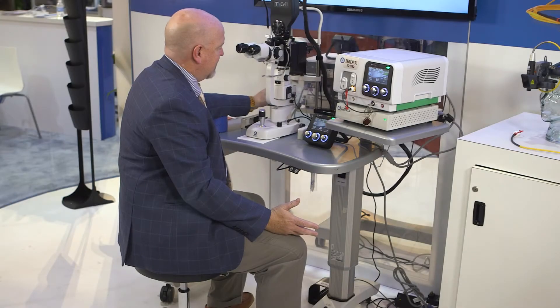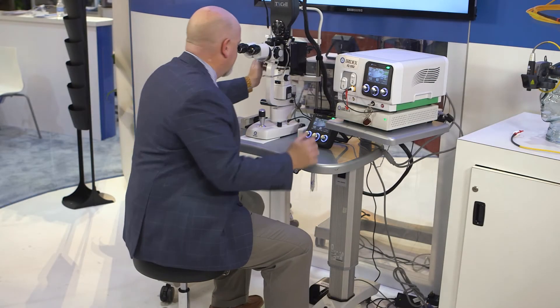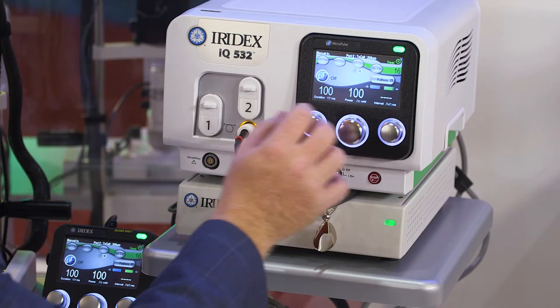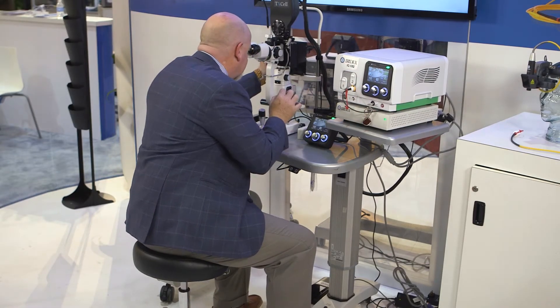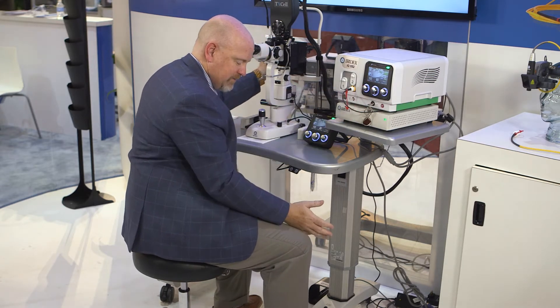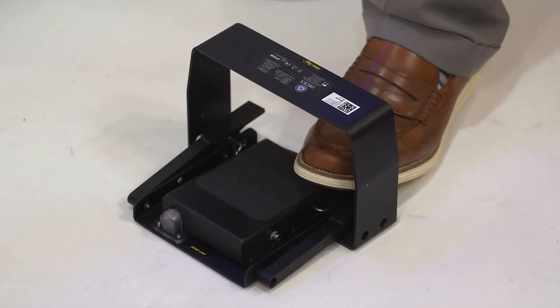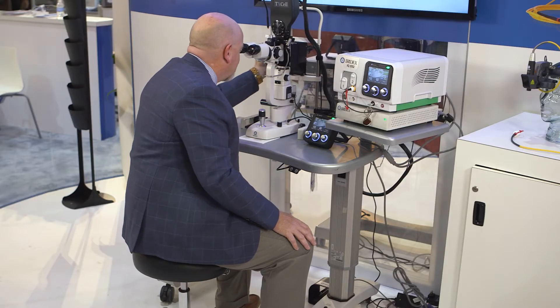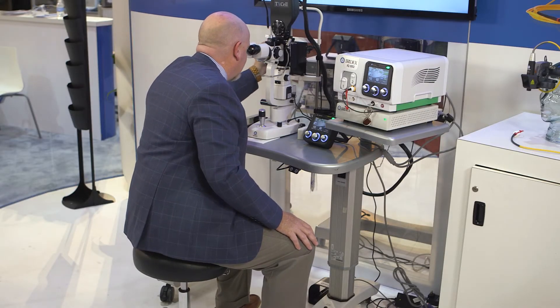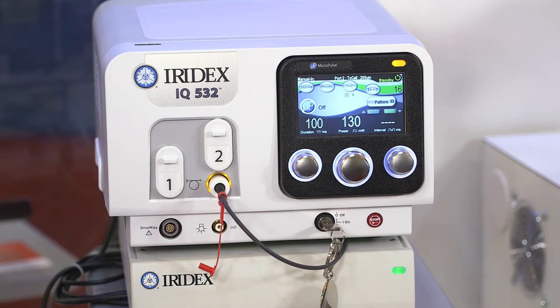With the wireless footswitch in place, here's the biggest advantage. As the physician is dealing with the patient, he no longer has to go back to the screen to make adjustments, back to the oculars, enter the spots, back to the screen. He can adjust power a little bit at a time while still maintaining focus on the patient's eye. The laser also gives audible confirmation so that he knows exactly what power setting he's fixed at.